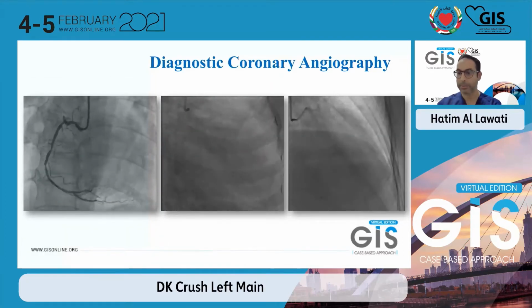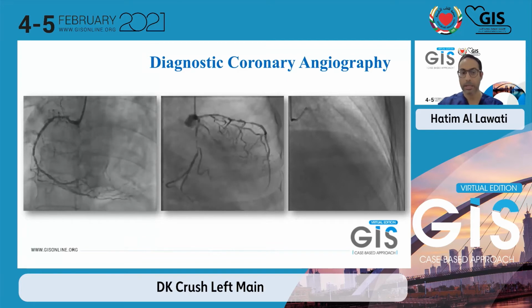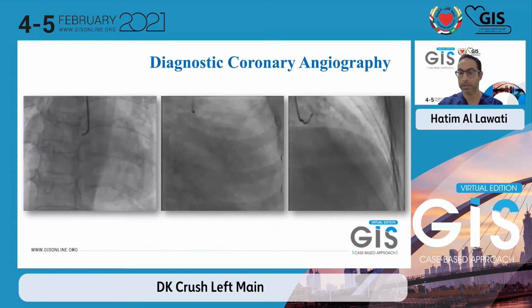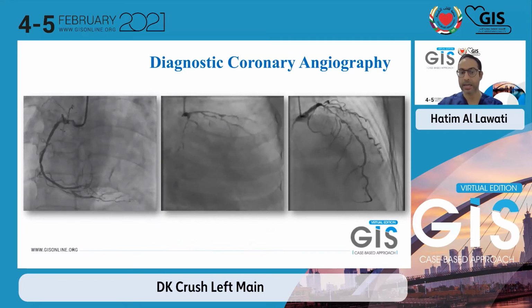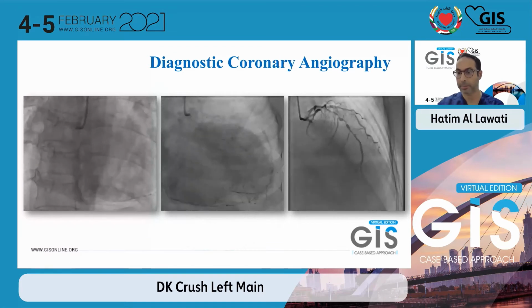The diagnostic coronary angiogram revealed moderate plaque in the right coronary artery involving its entire course in the proximal, mid, and distal segments. There was a focal 70% lesion in the mid-right coronary artery and a tight 90% lesion at the ostium of the right posterior interventricular branch.